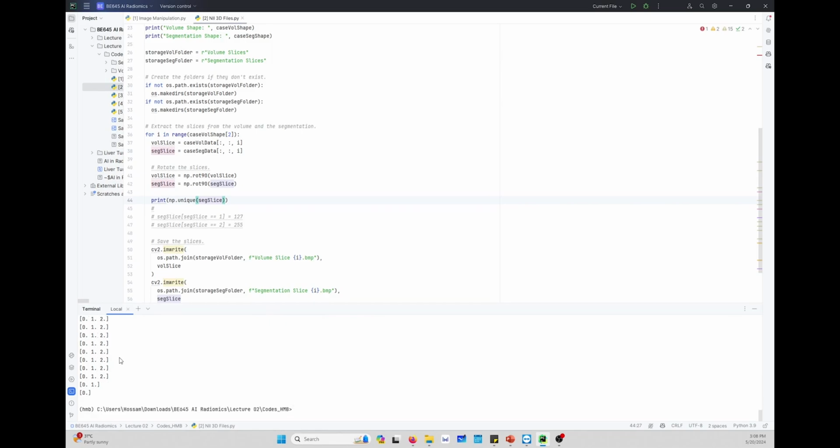If you found that, this means some images have only one class or one segmentation, and 0 here means background, which is black, and some of them have 1, which means this defines a specific class, and 2 here defines a second class. How do we handle that visually?